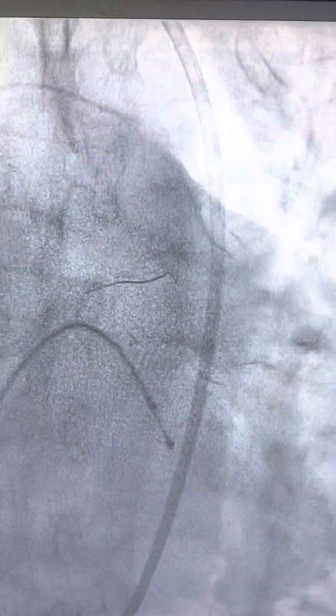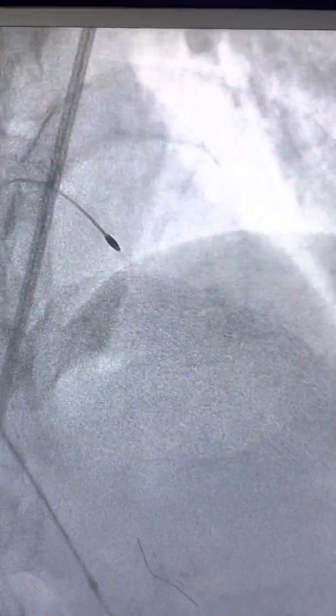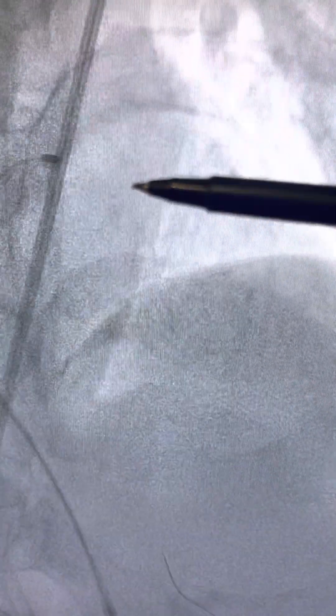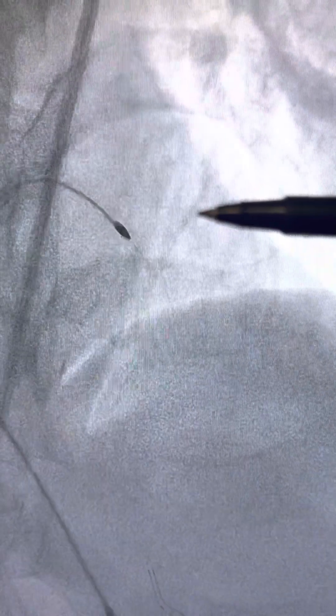We crossed the rotawire and then did multiple passes of this small burr, which is the rotabar — this is a 1.5mm rotabar. It is rotating inside the coronary artery at a speed of 1.5 to 1.7 lakh rotations per minute depending on the speed you set. I set the speed at 1.6 lakh rotations per minute in this case.